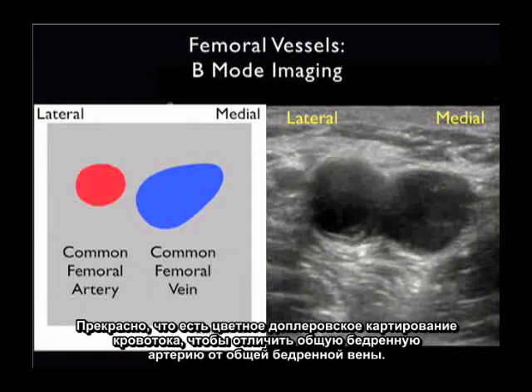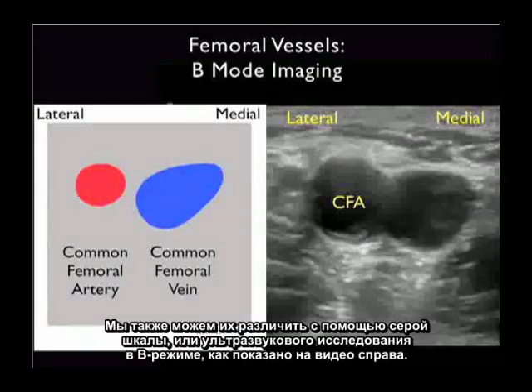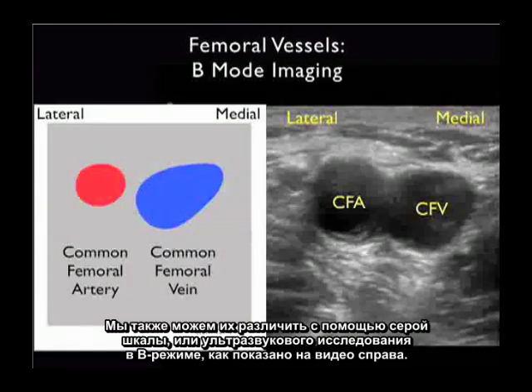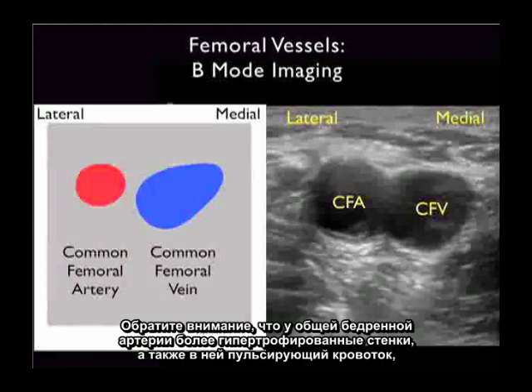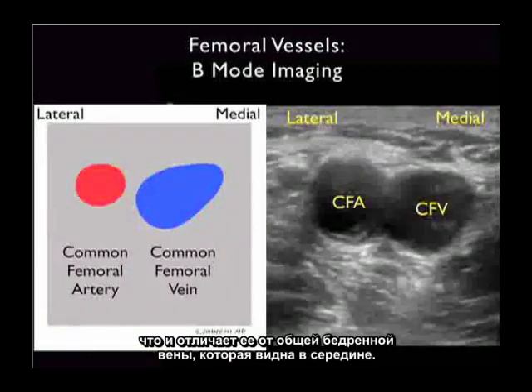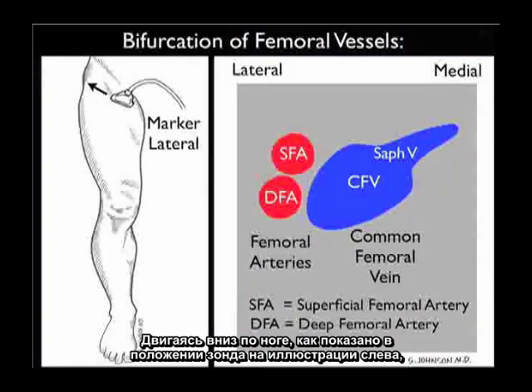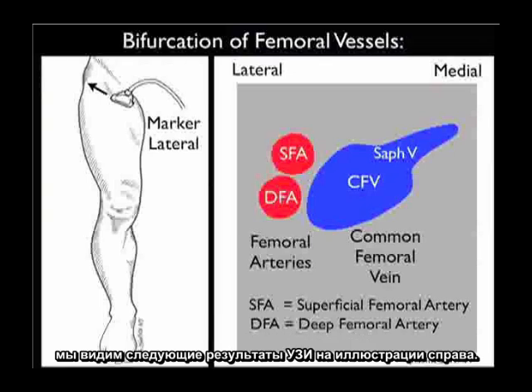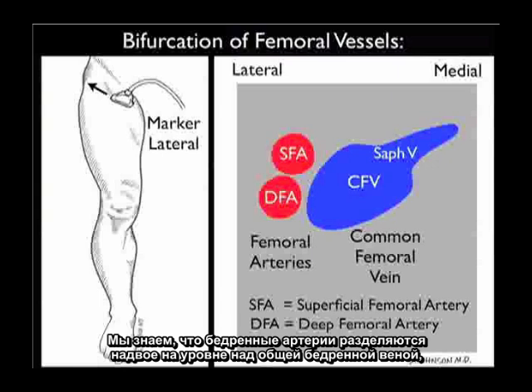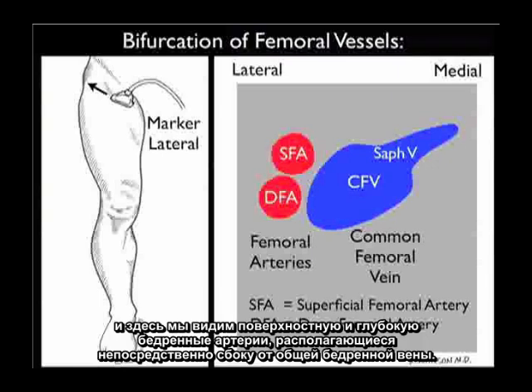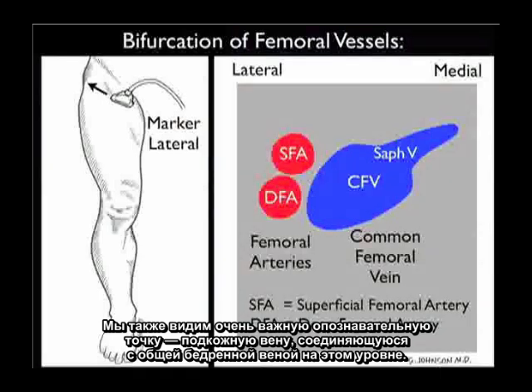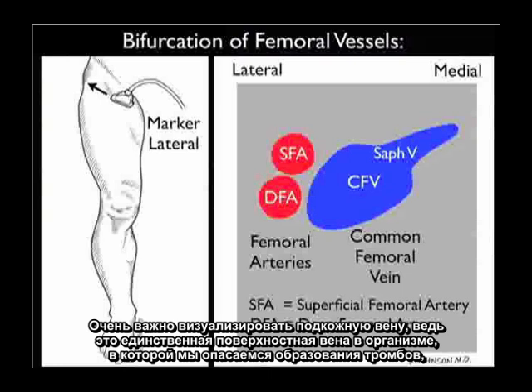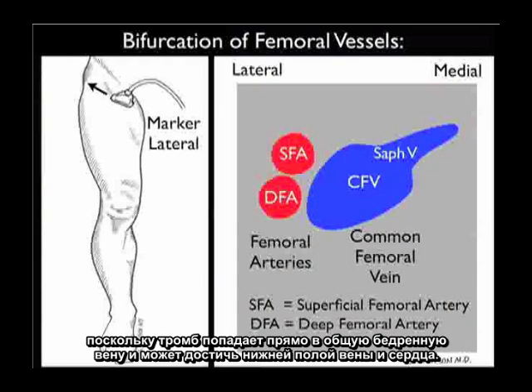While color flow Doppler is very helpful to differentiate the common femoral artery from the vein, we can also use grayscale or B-mode sonography. The common femoral artery has more hypertrophic walls and pulsatile flow, differentiating it from the common femoral vein seen medially. Continuing down the leg, the femoral arteries bifurcate at a level above the common femoral vein — we see the superficial and deep femoral arteries just lateral to the common femoral vein. It's important to visualize the saphenous vein as it's the only superficial vein we worry about for clot formation, as it goes directly into the common femoral vein and can propagate up into the IVC and into the heart.